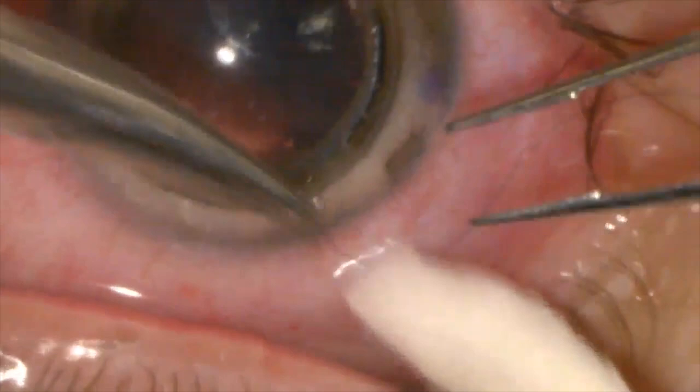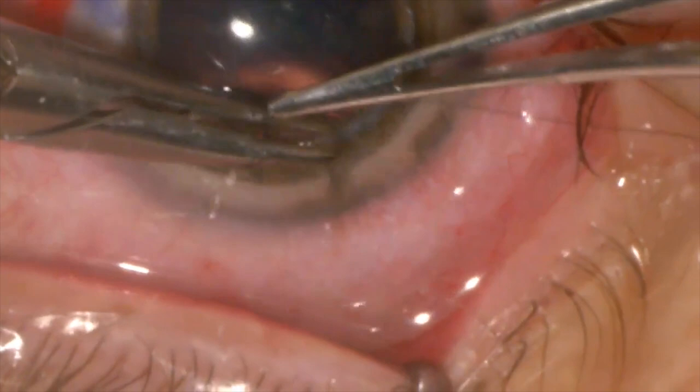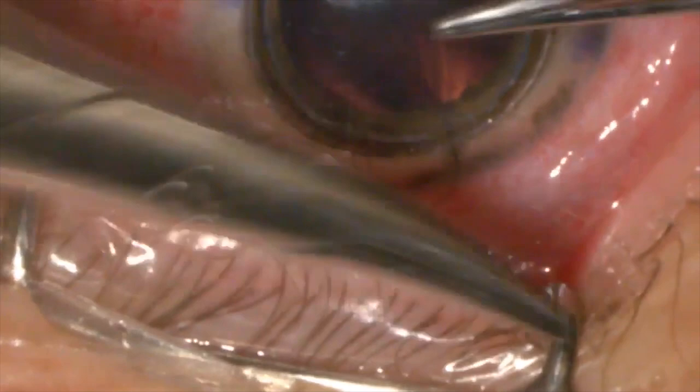We begin to remove the stitches at 4 months, depending on the astigmatism. And normally, after one year, we don't have stitches. After 1 year, when you have a good scar, we can do cross-linking, we can do PRK, but after 1 year, then you have a stable cornea and refraction.